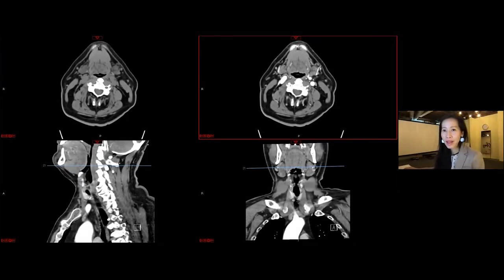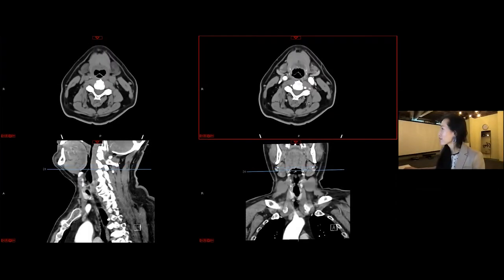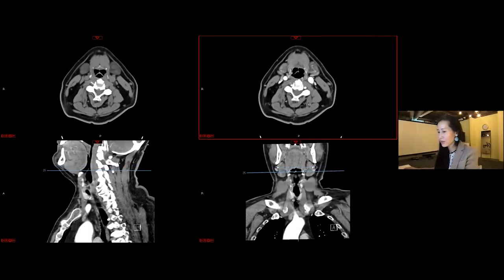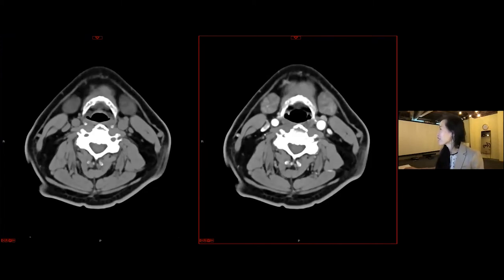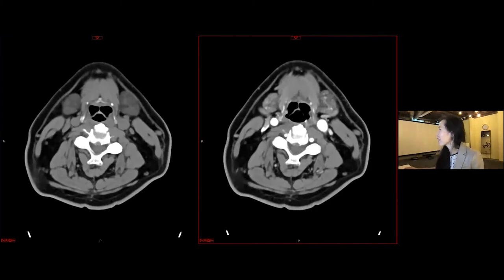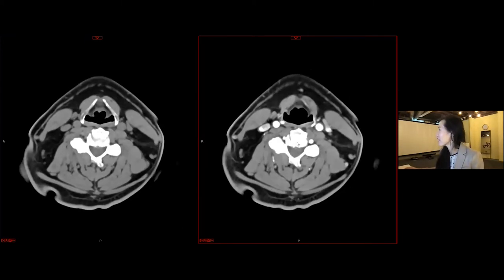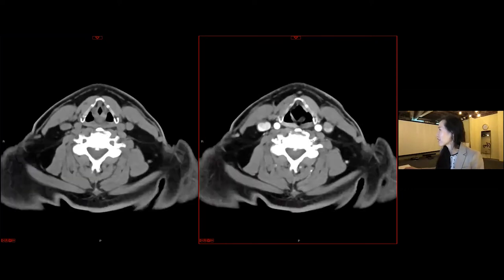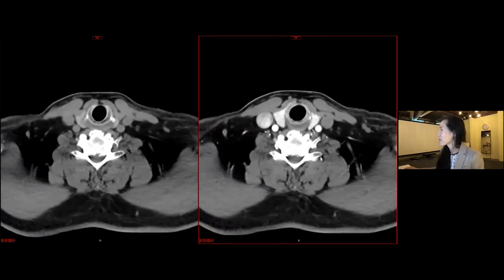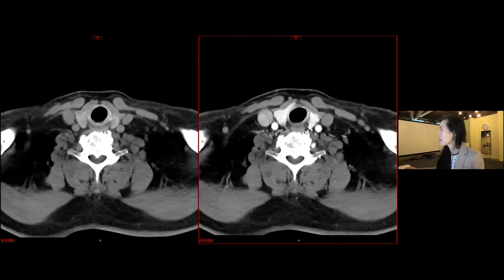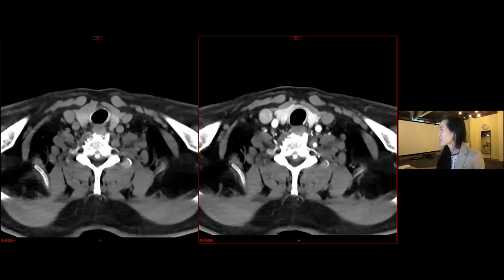Here we have case three in another patient with primary hyperparathyroidism — boring old history. Again, starting at the hyoid, focusing on the arterial phase in that eutopic location. Coming down, not seeing anything in our paraesophageal locations like the other two cases.